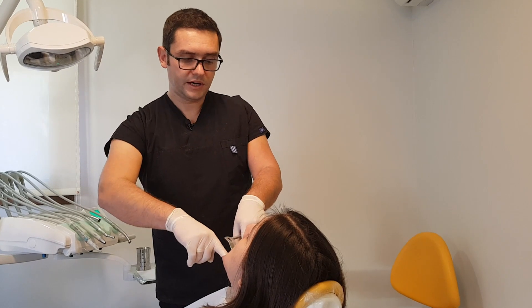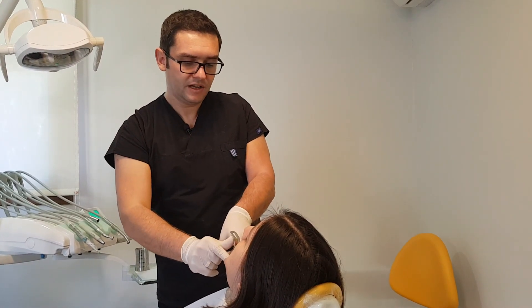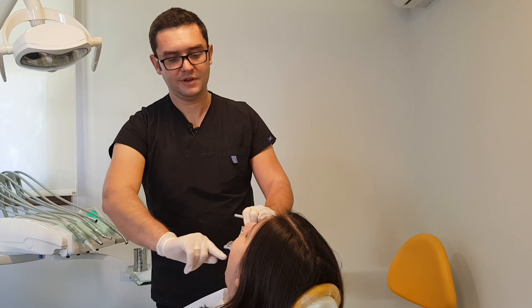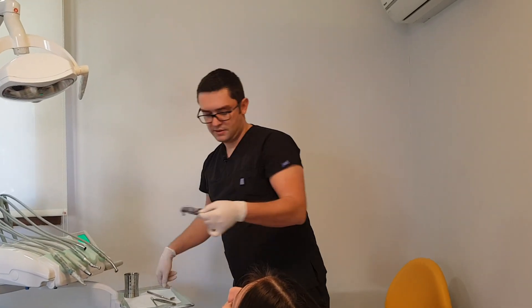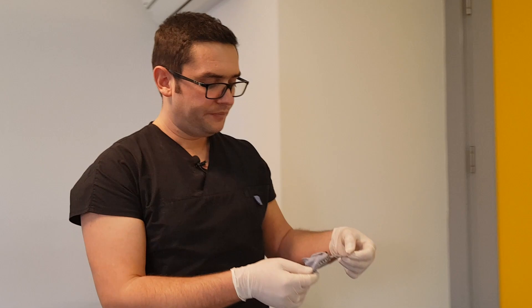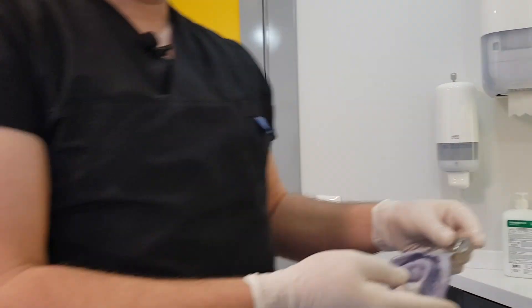Now I remove the impression tray from the mouth. Here, this is the impression.